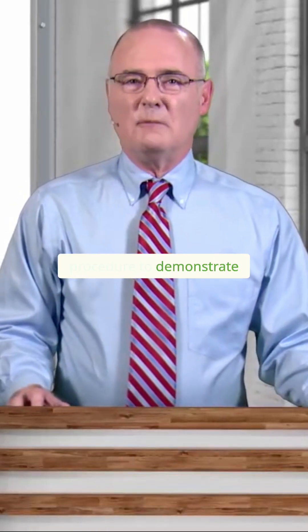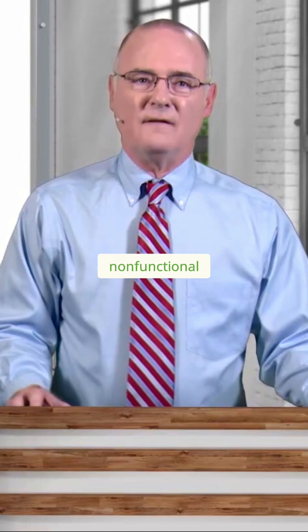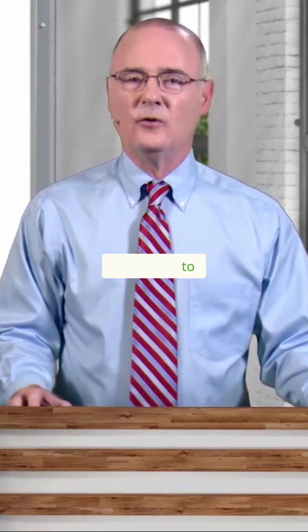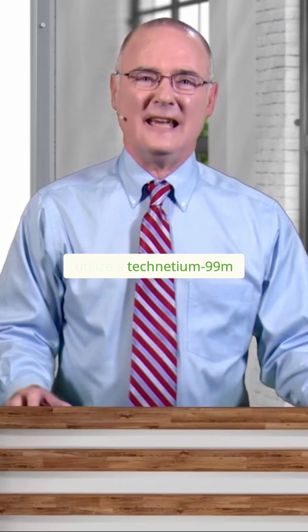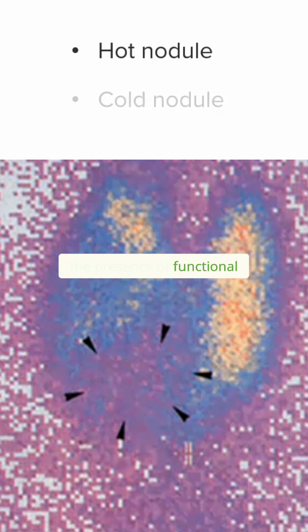A very common procedure to demonstrate whether or not nodules are functional or non-functional is to utilize a Technetium-99m pertechnetate scan. We see here in the image the results of such a scan. Hot nodules show up in this coloration due to the presence of functional thyroid nodules taking up the Technetium-99. These areas light up when you have a hot nodule region.